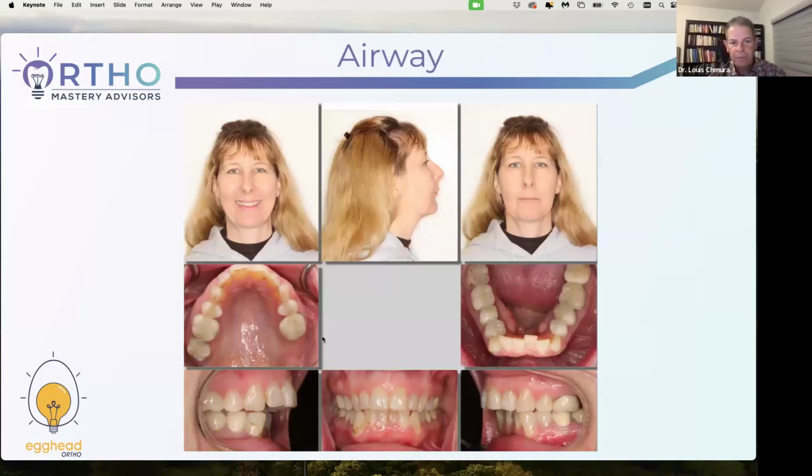So here's an example of somebody who came in and their primary concern is sleep apnea. Okay. And so I look at the profile. Of course they are. They had teeth out when they should never have. She was probably a jaw surgery case from the get-go. The upper jaw is narrow, right? And now she's an adult. Everything's collapsed in, especially the lower anteriors. She's got large tori, which take up tongue space. But I'm looking and saying, how are we going to get draw and retention on those lower anteriors?